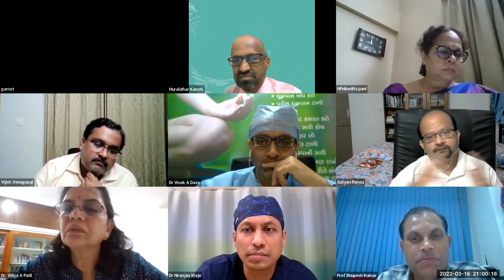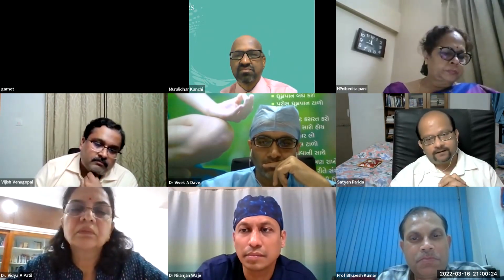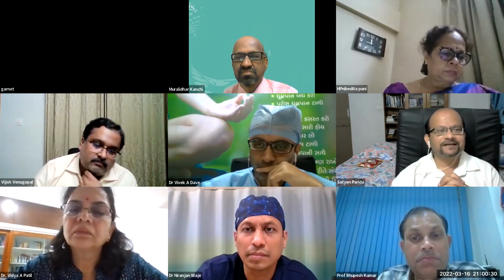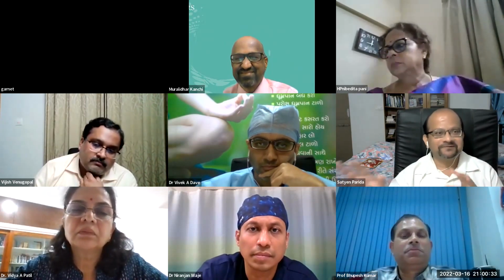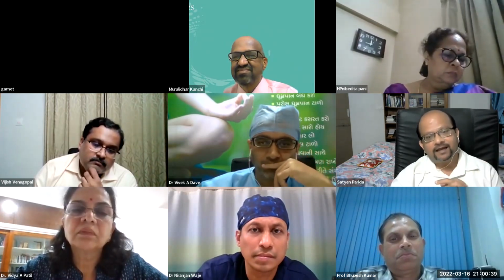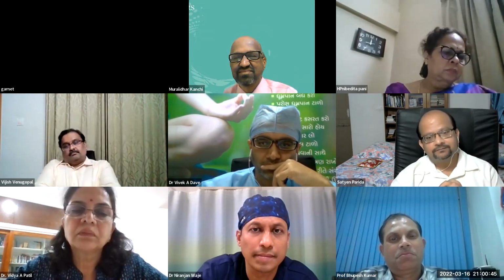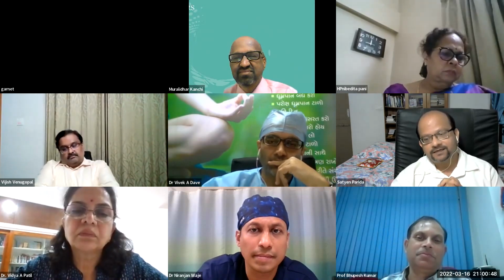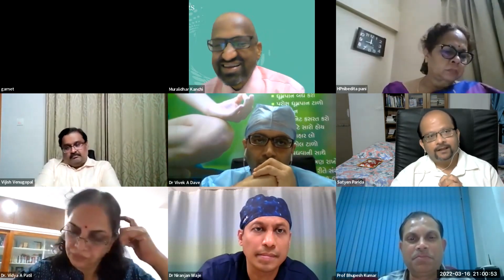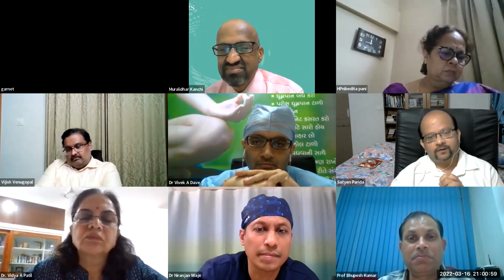My general view was that whenever the blood pressure started dipping down, the hypotension prediction index went up. Now, if I'm looking closely at the monitor, I don't need the hypotension prediction index to tell me that the BP is now close to 65 and in the next 5 minutes it's going to go below 65. But then again, I have not conducted a systematic study of the device. That kind of systematic study would be required before a final judgment could be passed on the HPI. But I think Dr. Thomas has done a lot of work on it. He seems to believe it's quite useful.